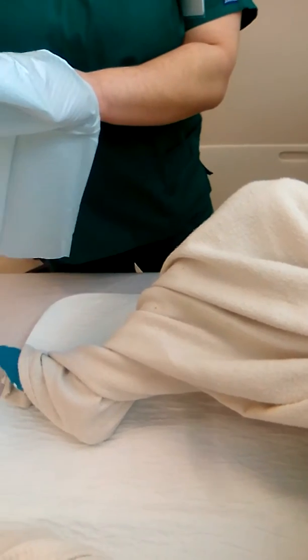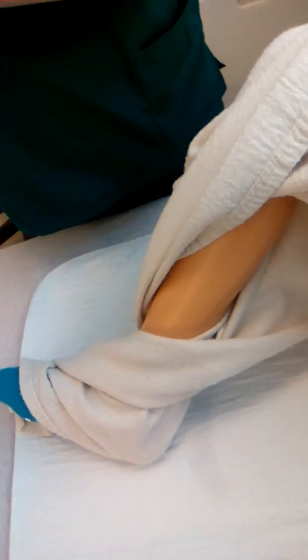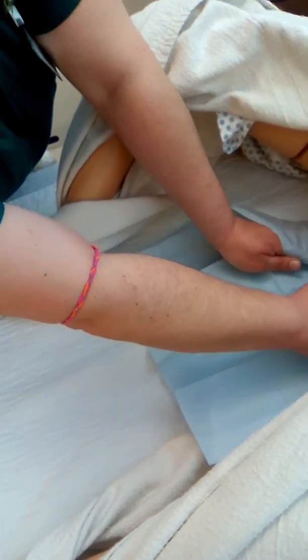Will you also move this blanket over here, right here? And then I'm going to reposition my patient and get them into the most comfortable position. And then I will place this underneath their buttocks as they lift up.